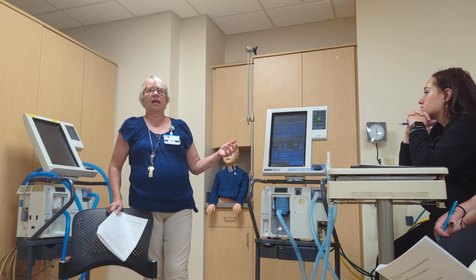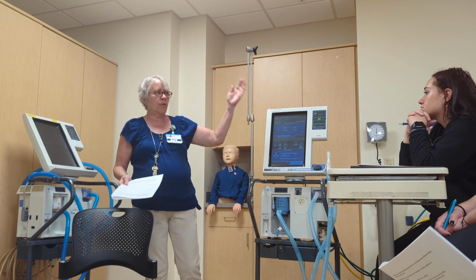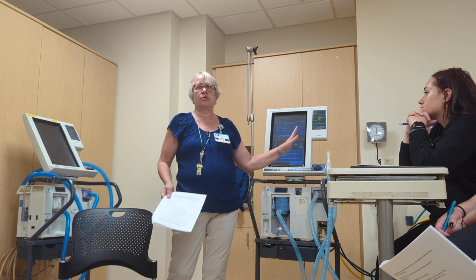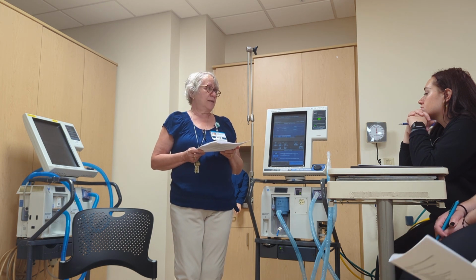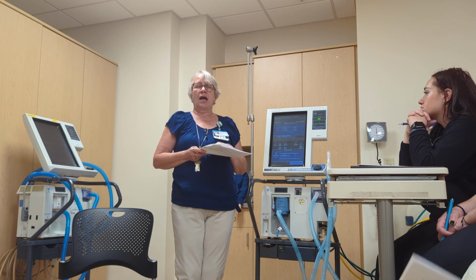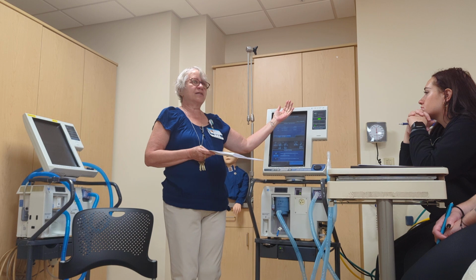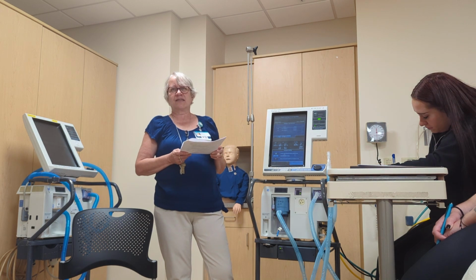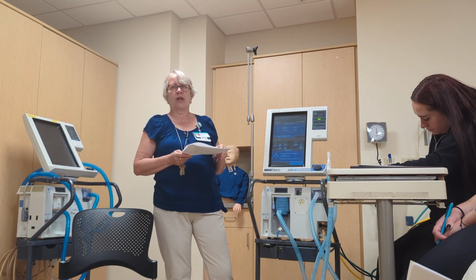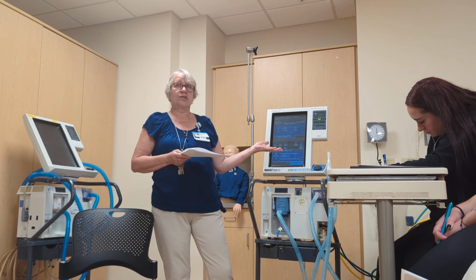It'll say, disconnect at the inspiratory side, plug this, do that, and it will run through it and prompt you on what to do, okay? That's how you run an SST. If you run it the first time and it fails, run it again. See what it's saying. If you have a leak, tighten all your connections up, okay? Run it the second time. If it fails the second time, then that ventilator probably needs to go be looked at. You might try to change the circuit.